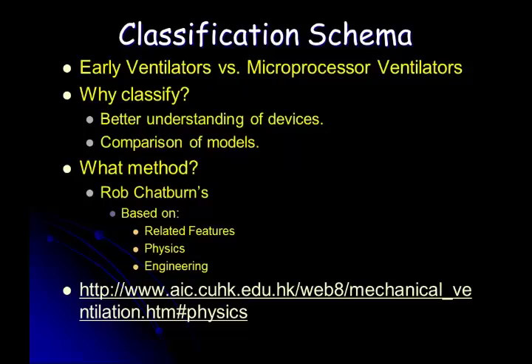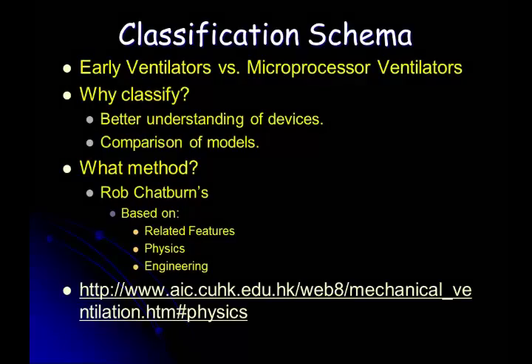There's an example of one of the modes of ventilation we'll talk about. And it was a salesman's line. One time a therapist said it to me, and I said, think about what you just said. The line was, "This mode delivers the breath at the lowest possible pressure." What, other ventilators sit around and say, "Hey, I can ventilate at 20, but I'm going to ventilate at 25?" It's like, duh, all ventilators deliver the breath at the lowest possible pressure.